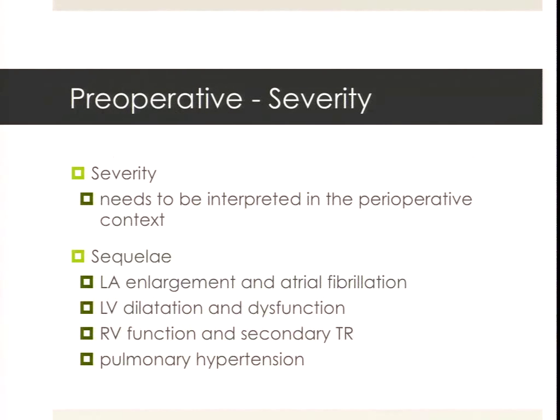Now, severity in the perioperative context is really a very difficult beast to address, and this becomes a real issue when you're trying to assess severity of postoperative leak. Preoperatively, it's not that much of an issue because that's already been established generally. By the time they've come to surgery, you're not going to turn around and say, well, I see their MR being a little bit less and they're not going to be done. It's been established on preoperative studies.